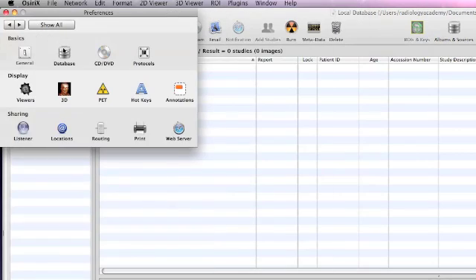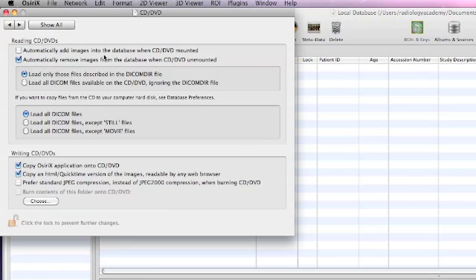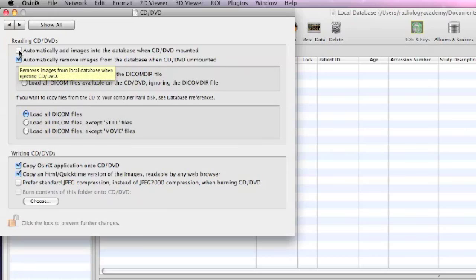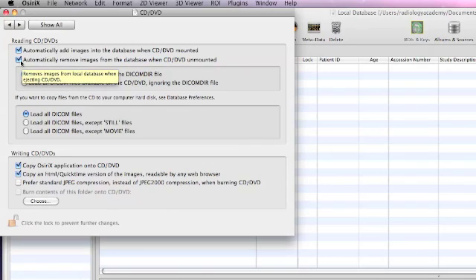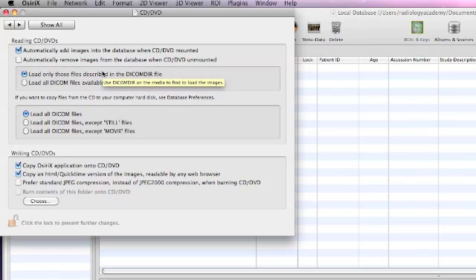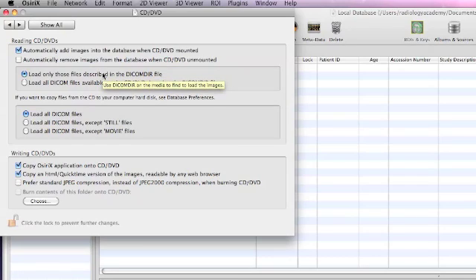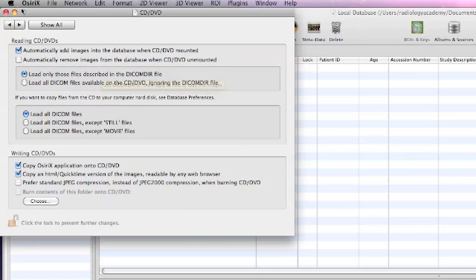The final preference window is the CD preference. The first option, currently unchecked, is 'automatically add images into the database when the CD is mounted.' We should check this so every time we put a CD in, it will automatically be updated. Secondly, we should uncheck the subsequent one, which stops images being deleted from the database when the CD is removed. Now, as soon as the CD is ejected, the information will be maintained on that database.